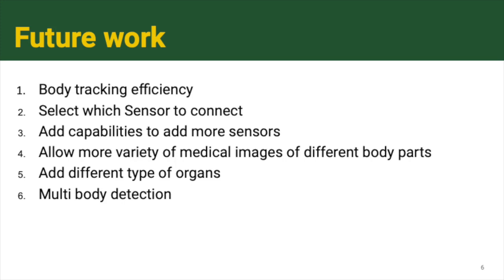Another improvement to the app will be to allow for different medical images of different body parts. Currently, it only works with images on the back, which is limiting to just back surgical procedures. Therefore, by implementing this feature, this will allow for the app to help out with a wider range of procedures. This should not be too hard to implement, as it's still using ARKit's body detection features, and picking out the right points to extrapolate from will be the difficulty.